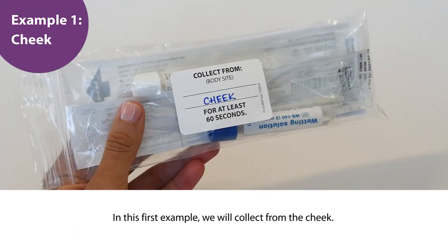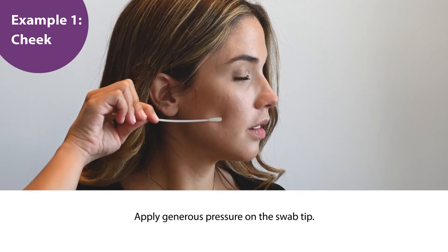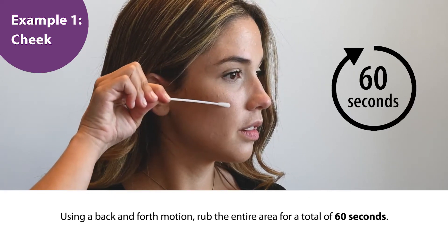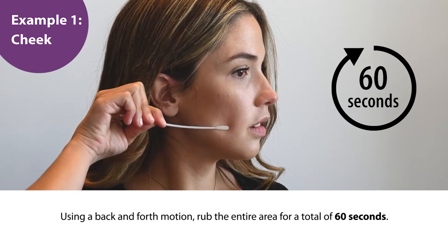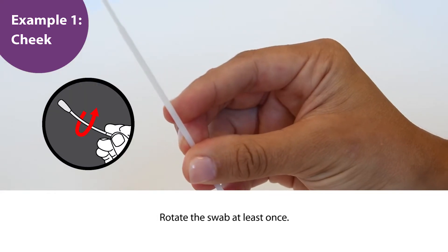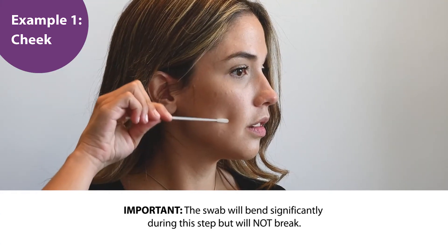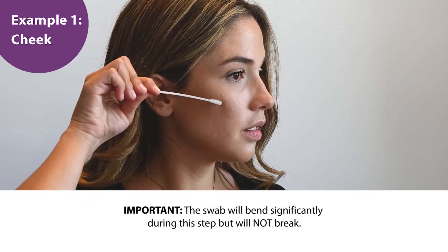In this first example, we will collect from the cheek. To ensure a successful collection, apply generous pressure on the swab tip. Using a back and forth motion, rub the entire area to be sampled for a total of 60 seconds, rotating the swab at least once. Important: the swab will bend significantly during this step but will not break.